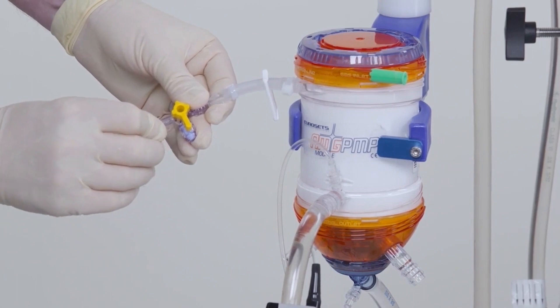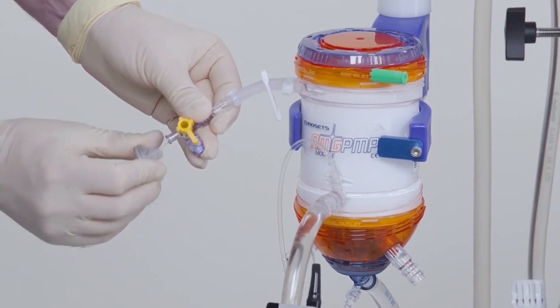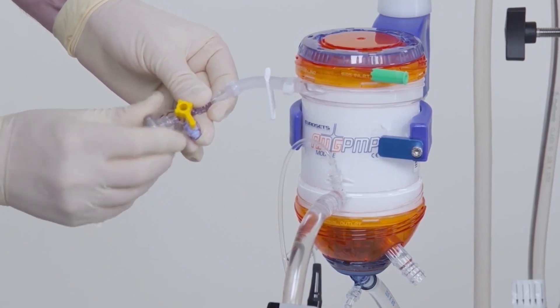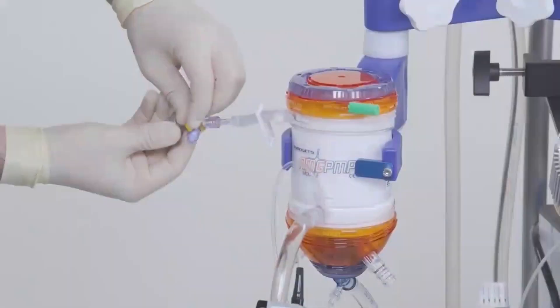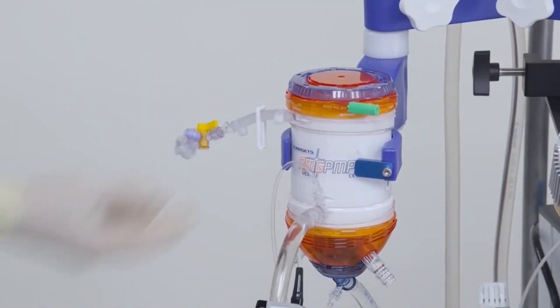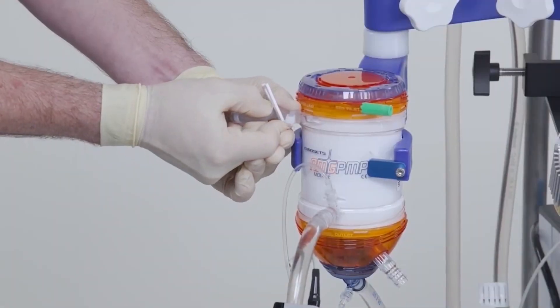If air is present, remove it through the purge line. Then close the stopcock and slide the white clamp closed.